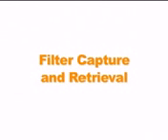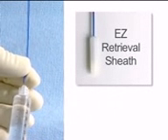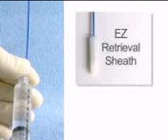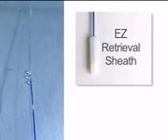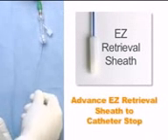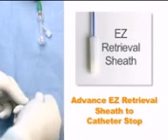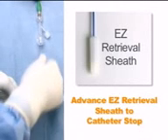Filter capture and retrieval. For filter retrieval, use the EZ retrieval sheath indicated by a white handle. After removing the sheath from the packaging coil, flush it with heparinized saline, being careful not to damage the tip with a syringe. Backload the retrieval sheath and advance over the protection wire until the tip of the retrieval sheath reaches the catheter stop, just proximal to the filter loop.